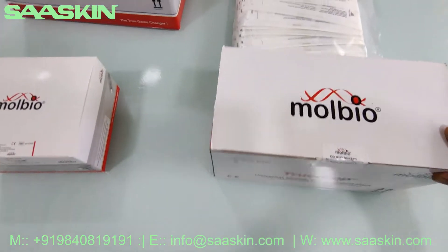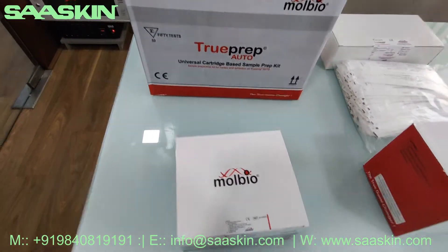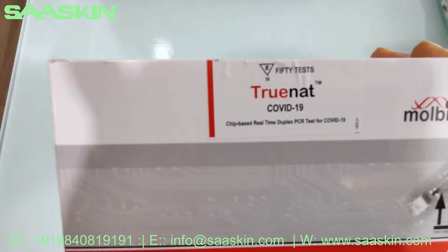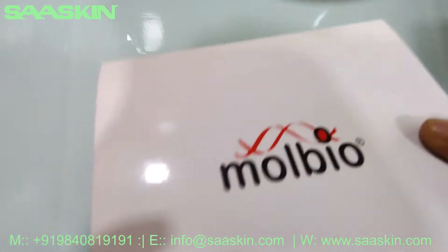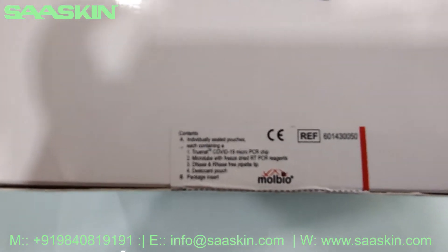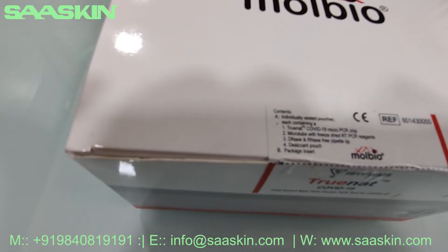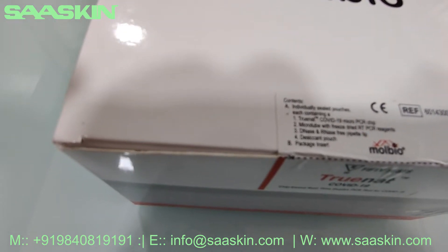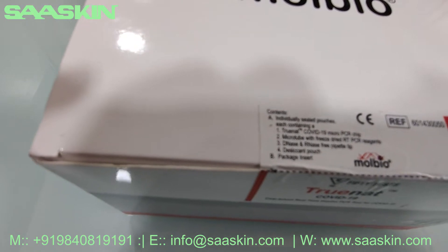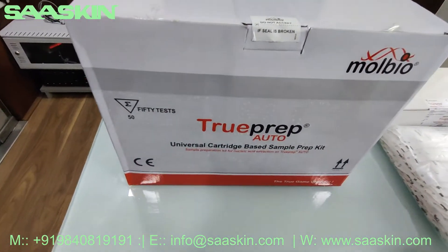Next I would like to introduce the chip used for this testing, which is the 50-number COVID chip. The contents of this chip box include individually sealed pouches, each containing a TrueNat COVID-19 micro PCR chip and a micro tube with freeze-dried RT-PCR reagents DNase & RNase-free pipette tip, and a desiccant pouch.